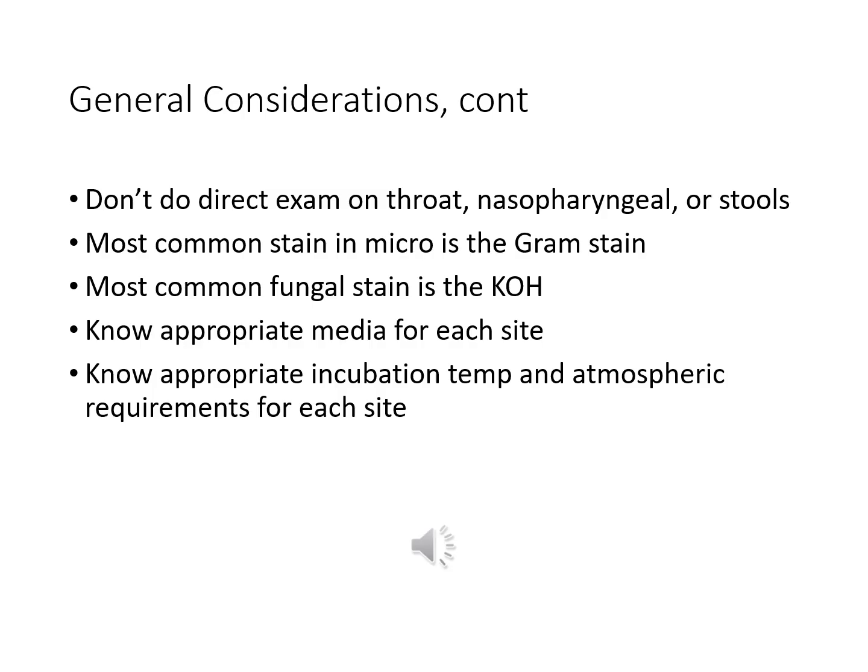Your most common stain in microbiology is the gram stain, and then the most common fungal stain is going to be your KOH prep, which we'll talk about later. Make sure that you know appropriate media for each site, as well as knowing appropriate incubation, temp, and atmospheric requirements for each.